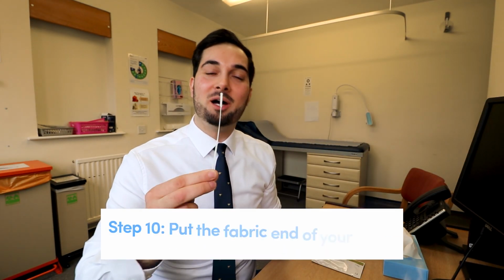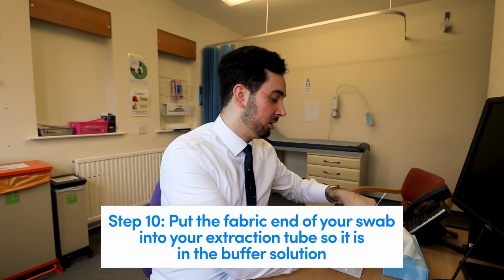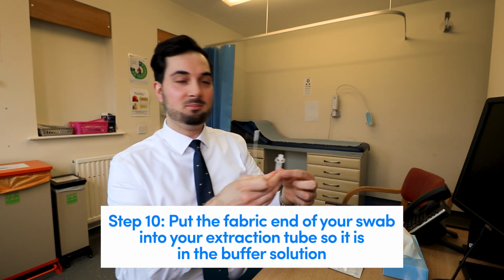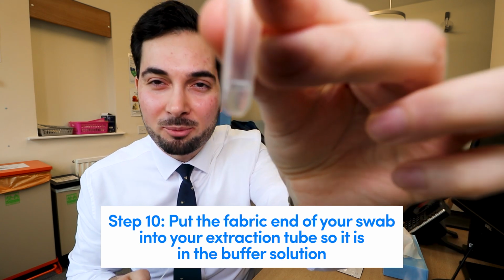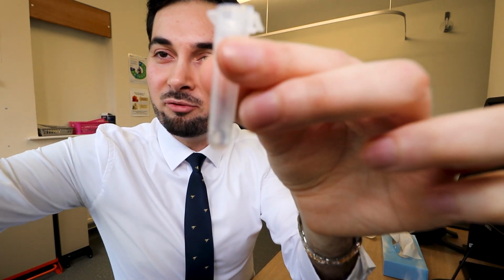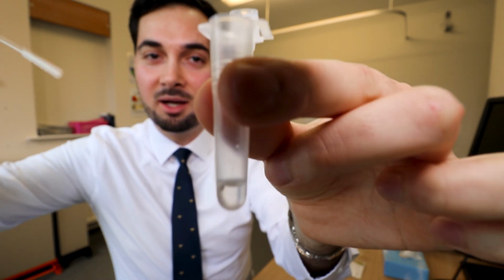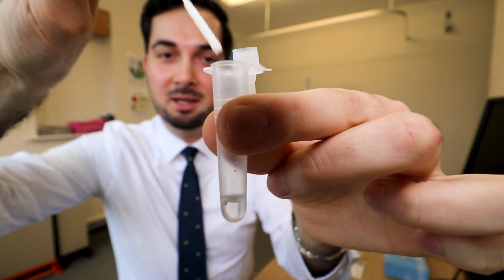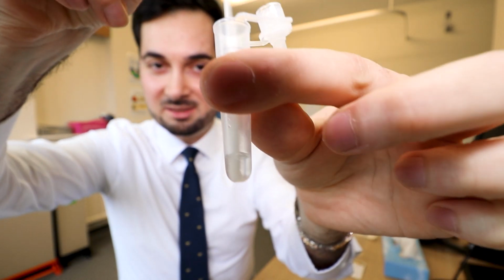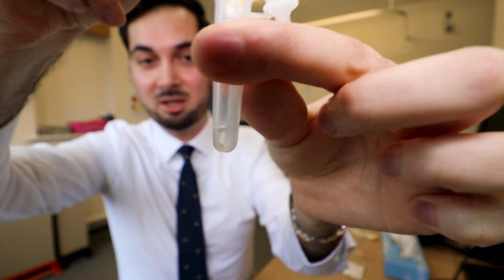So I'm going to move this out of the way. Let's move on to the next scene. So moving on to step number 10, all the hard parts are done now. We've got our sample ready, and remember, we've got our buffer solution ready in our sample tube like so. You can probably see the liquid there slightly, okay? So what I'm gonna do is try and focus on this, see if that's better. Okay, so I'm gonna put this into here, and I'm gonna mix it in there for about 10 to 15 seconds. Okay, and keep twisting it.